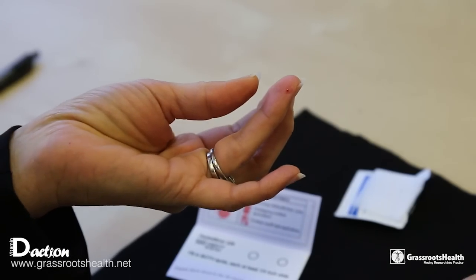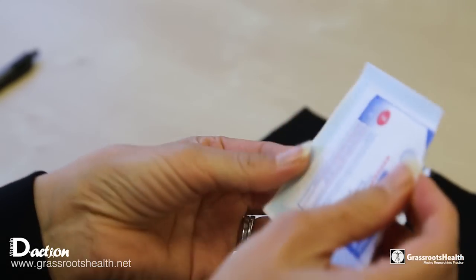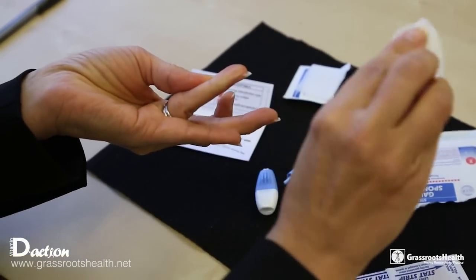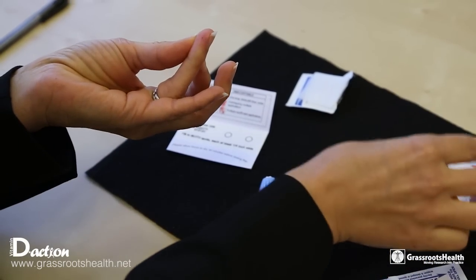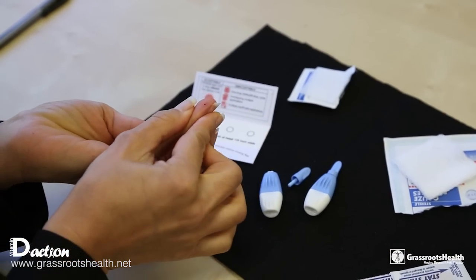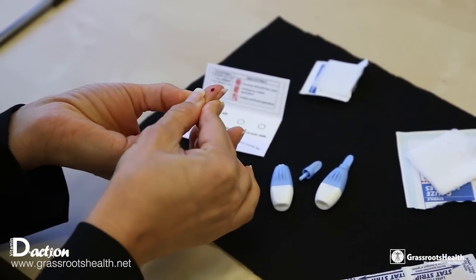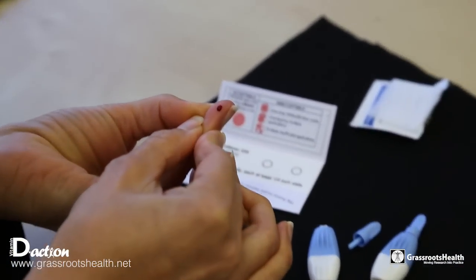At that point you will want to immediately wipe it with the gauze pad. This really is important and helps with the blood flow and it helps start it. And periodically during it, if the blood isn't flowing, you can wipe again and it helps with the blood flow.